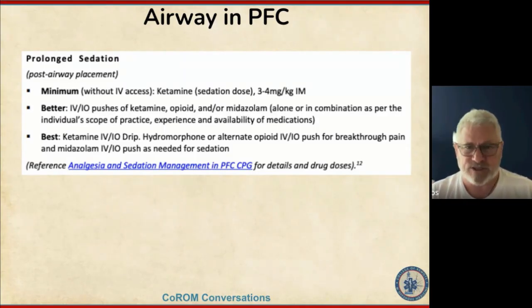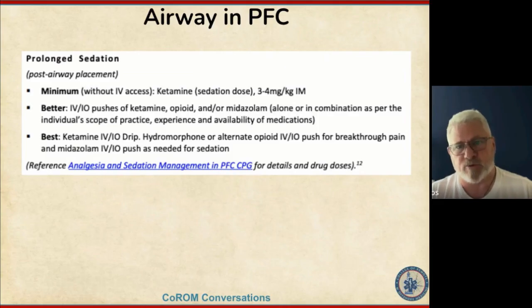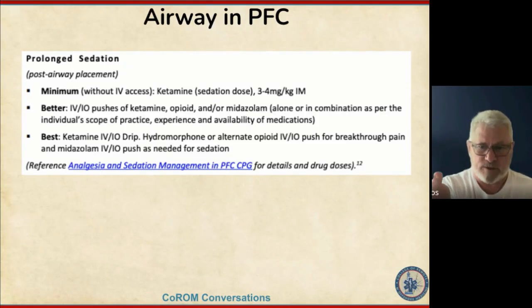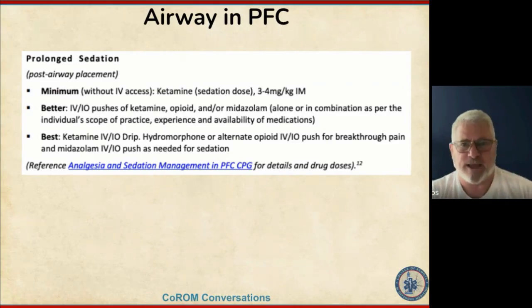So you have to get the seal first, get those first couple of breaths in there to open it up, and maintain a seal so the PEEP is effective. I don't think we hear it enough in training that when you're holding the BVM, your palm should be up and the bag should sit in your hand. That's going to help maintain that seal, just as good technique.